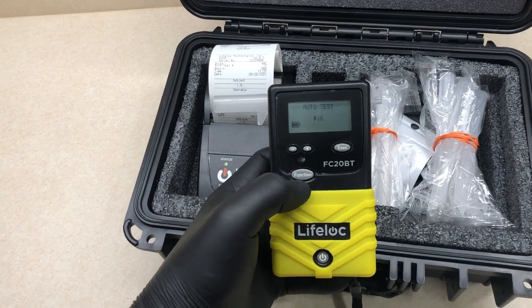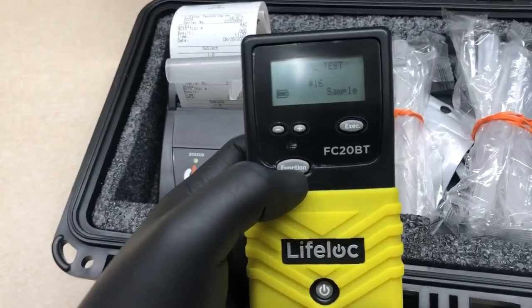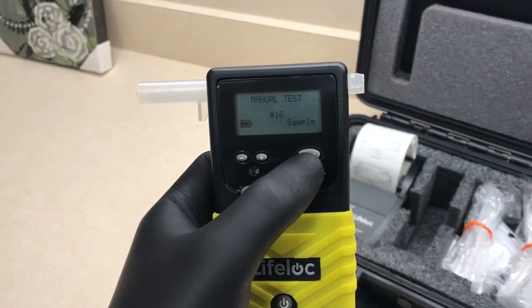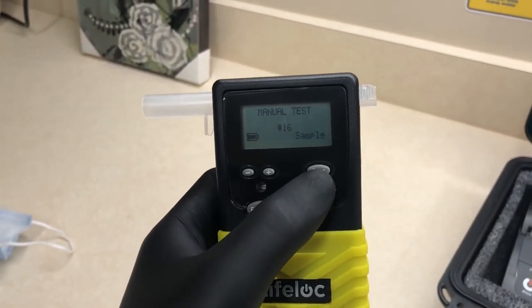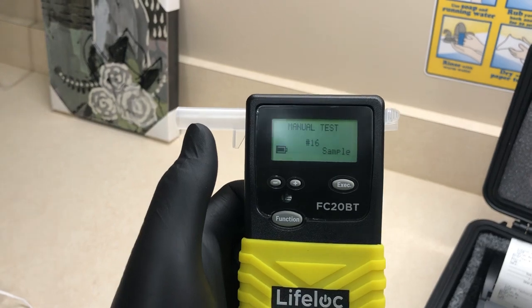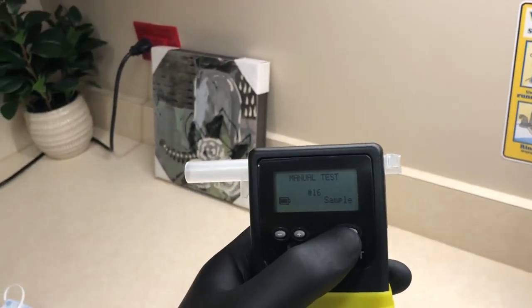So what you're going to do is go to function. You're going to switch it over to manual. It's going to say manual test now. With the manual test, you're going to say they give you 2 seconds of air through the straw right when they're near the end of their breath, or near the end of exhaling. You're just going to hit execute, and it's super sensitive. It'll grab the sample and tell you what the blood alcohol concentration is. So we'll go over that real quick and show you.